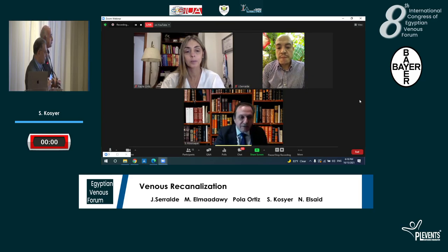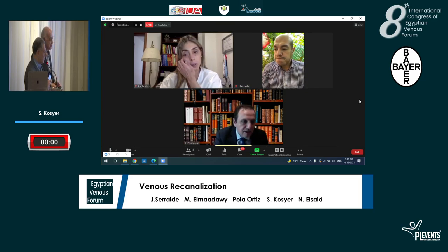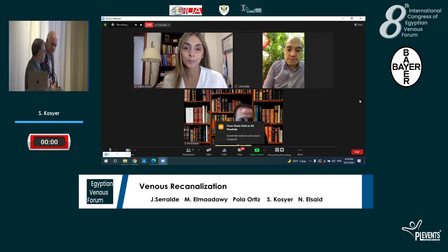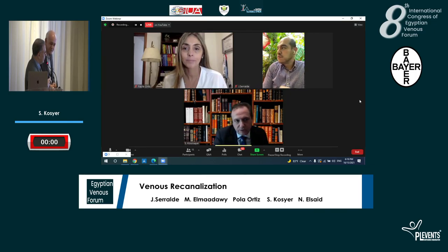Professor Mahathir, very nice presentation, I really appreciate that. We are liberal with stenting, not just angioplasty. For some reason, we had a bad outcome with angioplasty alone. So any time we doubt and think the patient has residual stenosis, we prefer to stent.